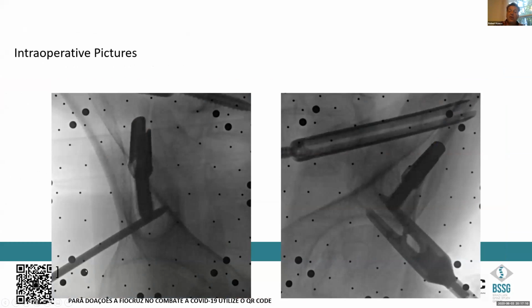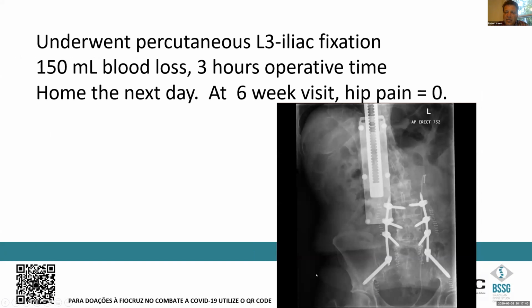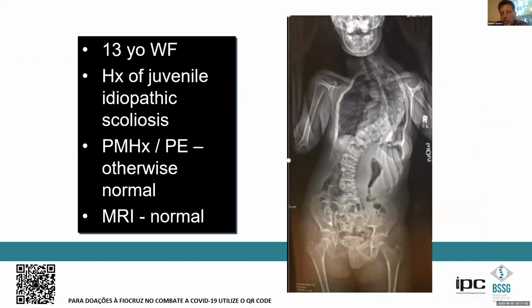And you can see, even though these systems typically have reference arrays placed into a crest, and then they have another extra reference array placed in the opposite side of the hip in order to confirm that there's no skiving or movement of the registered anatomy as a check on the system, you can place these screws even despite having the arrays in place, which is nice. The person has a nice post-op result, has significantly less pain, and is able to be more functional as they have a very limited life expectancy. We've actually made it a lot easier for that person to survive.